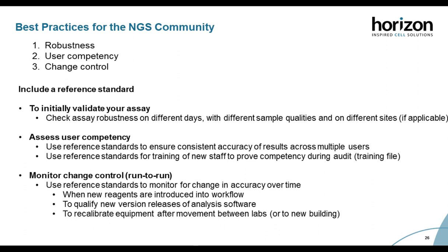It's also important to assess user competency, and reference standards can be used to ensure consistent accuracy of results across multiple users. This can also be very beneficial to labs who might have new staff to train and to prove their competency during audit, where the results of how they sequence the reference standard can be kept in their training file.